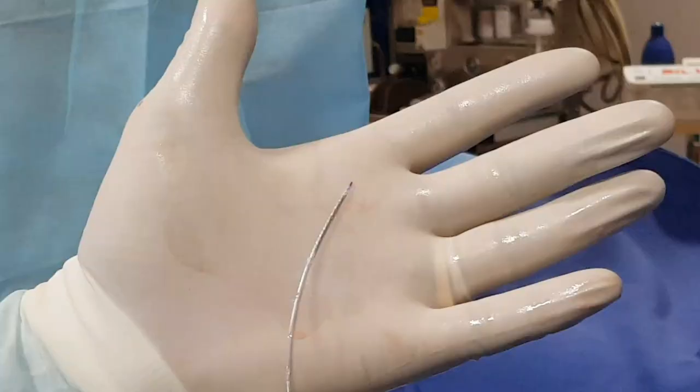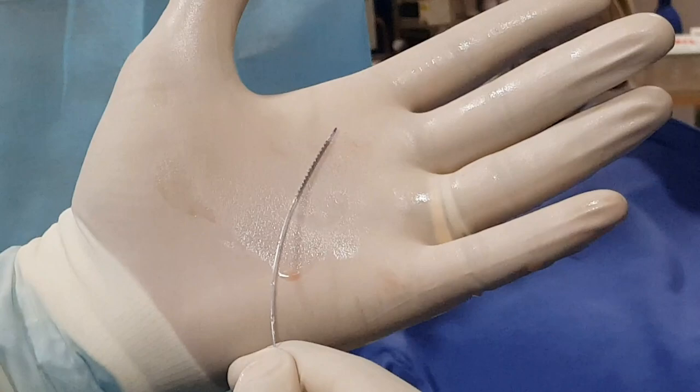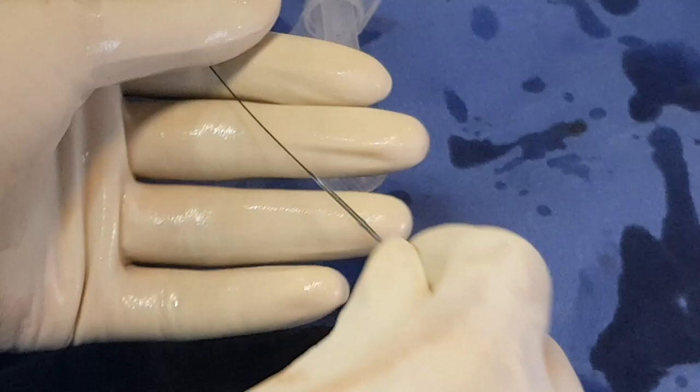This is the stent. After measurements, I have selected a 2.75 millimeter diameter, 23 millimeter length stent. This metal alloy is the stent, and there is a drug coated on it — so it is a drug-coated stent. She will thread it and give it to me. The stent is connected to an inflator just like the balloon. Now I am advancing the stent through the guiding catheter.